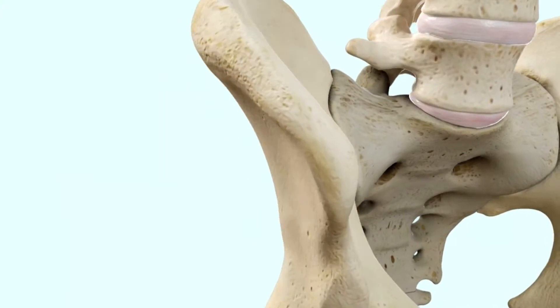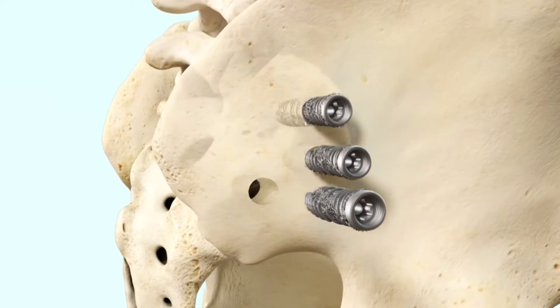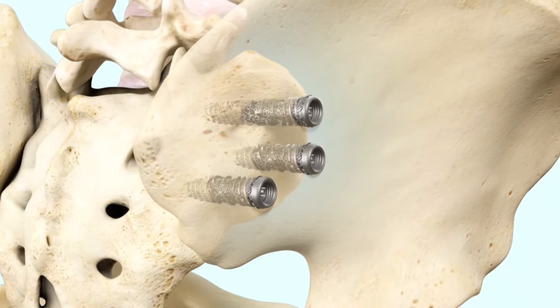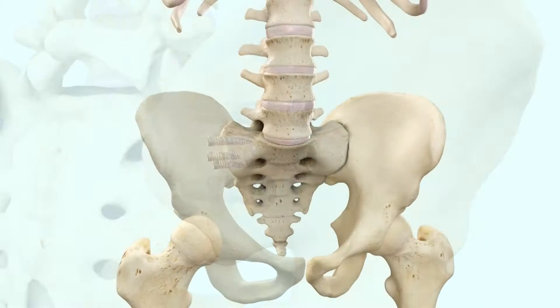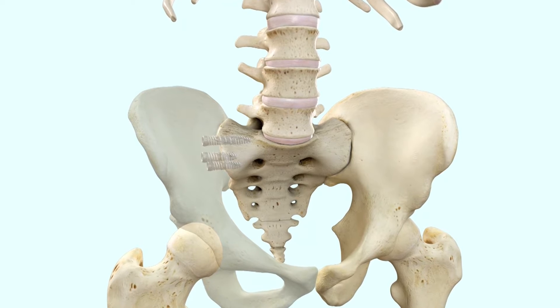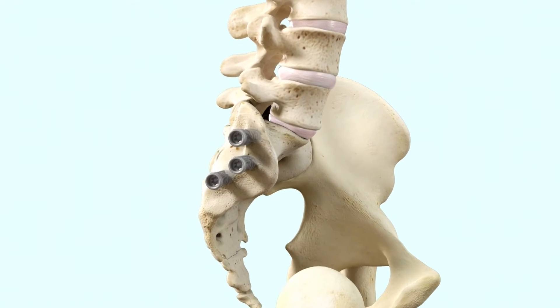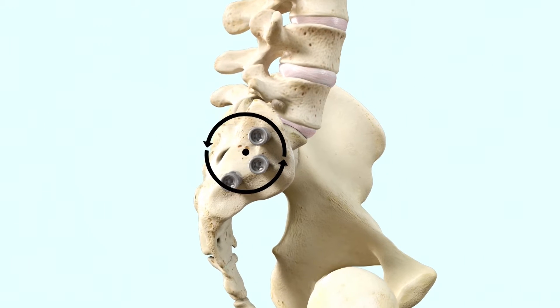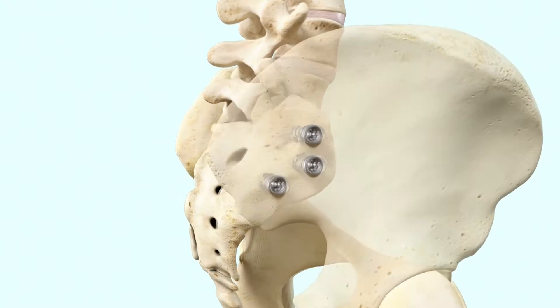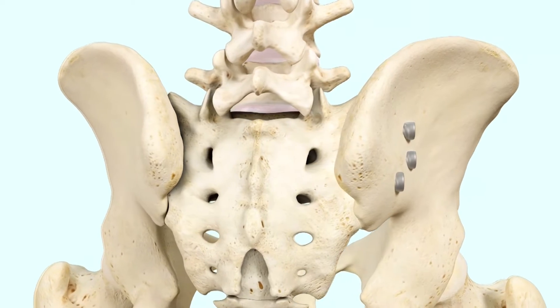Through a small incision of about three centimeters, typically three titanium implants are inserted through a tissue protector in a lateral to medial orientation to transfix the SI joint. The transiliac procedure allows the iFuse Torque implants to be placed through the dense subchondral bone of the cartilaginous joint, parallel to the axis of rotation and farther from the center of rotation to maximize biomechanical stability, creating an optimal environment for fusion and potential pain relief from SI joint dysfunction.